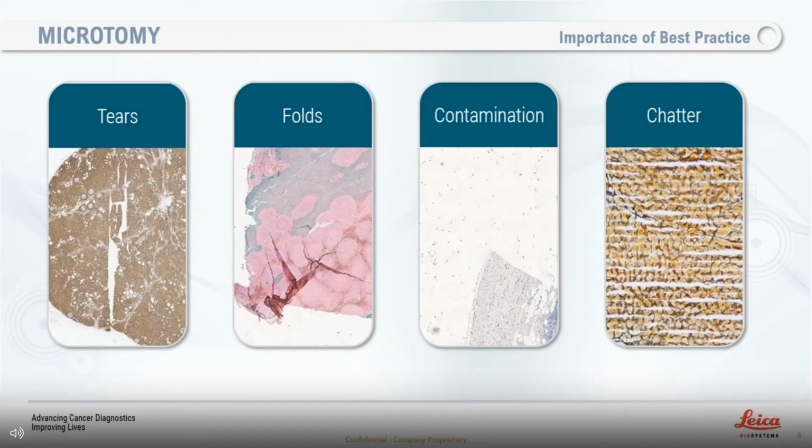Then as we move on from embedding and into microtomy, there is a massive importance of best practice. Some of these things aren't exclusive to digital pathology or digital ready slides. However, they can be exaggerated when you move into a digital environment. Again, if you look at something like tears, they're annoying and bothersome when you're reviewing under a microscope.